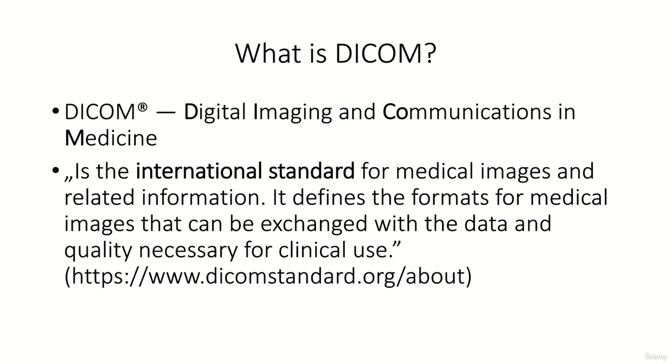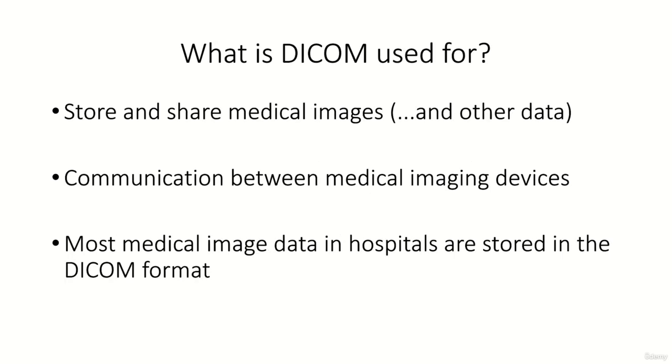Now that you know what DICOM actually stands for and what it means, let's talk about how DICOM is used in the medical field. DICOM is a file format for medical images which allows storing and sharing of those images. As you will see later, it does not only capture the sole image, but a lot of additional data.